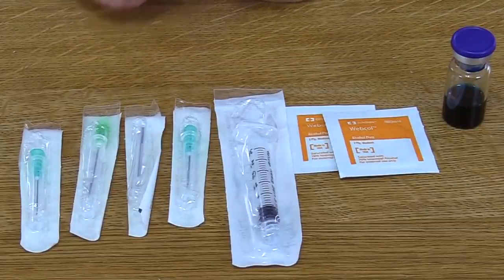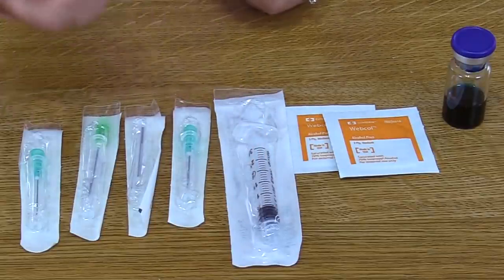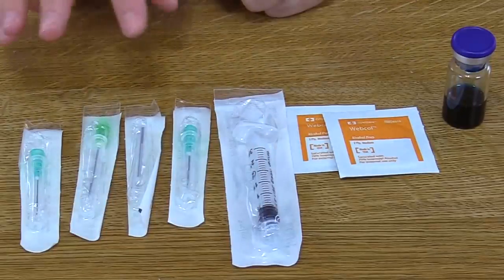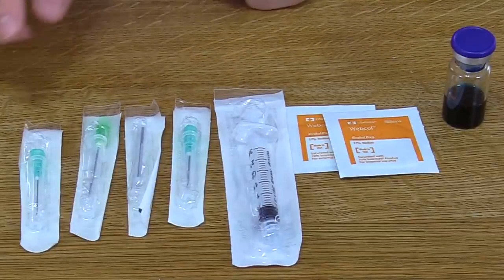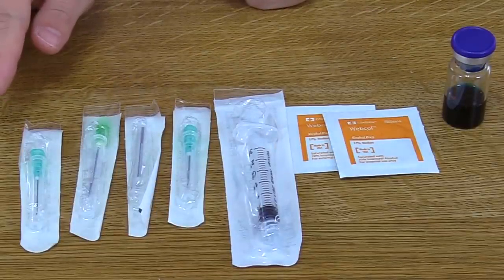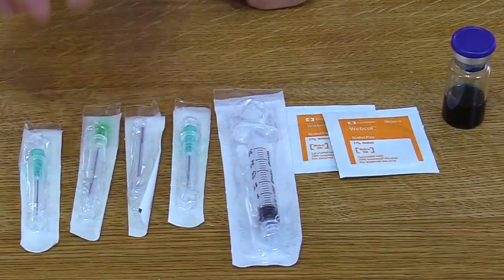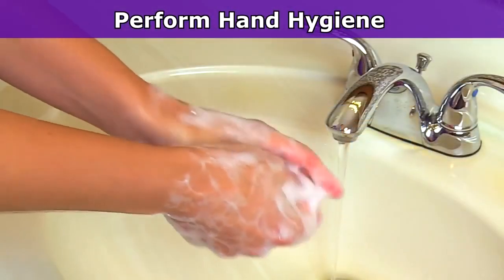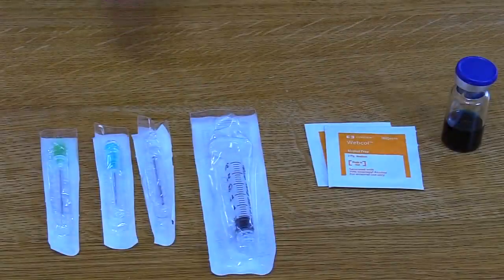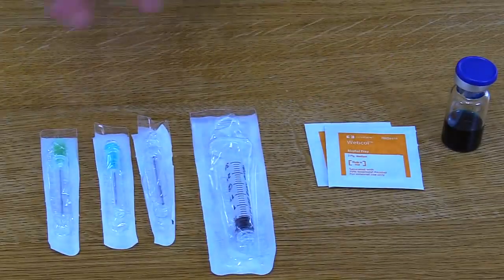You also need a vial access device that's going to attach to the syringe's needle adapter to actually help you withdraw the medication from the vial. There's various things you can use to help you withdraw the medication, which we'll go over in a second. And then you're going to need an extra needle to actually administer the medication, because you're not going to use the original access device that you attached to the syringe that helped you draw up the medication. Then you want to perform hand hygiene. After you've done that, you want to set up the syringe and attach the vial access device to the needle's adapter if needed, because some may already be prepared.